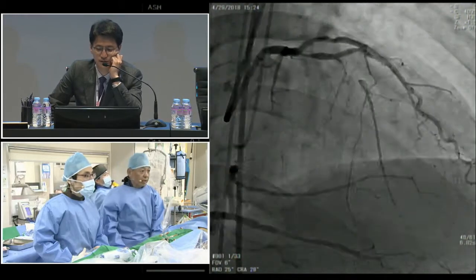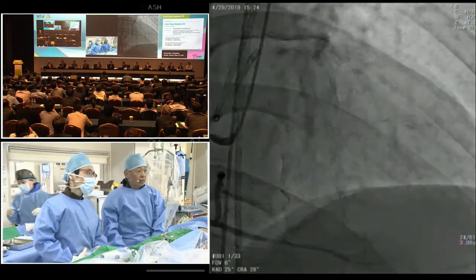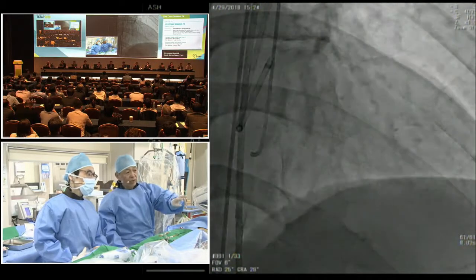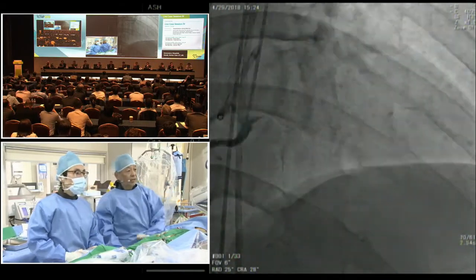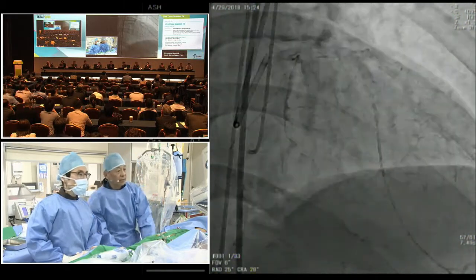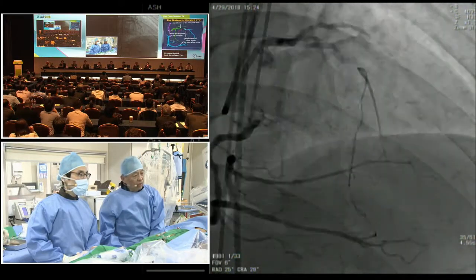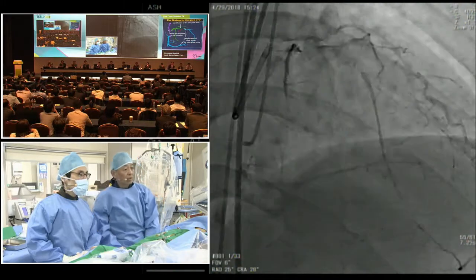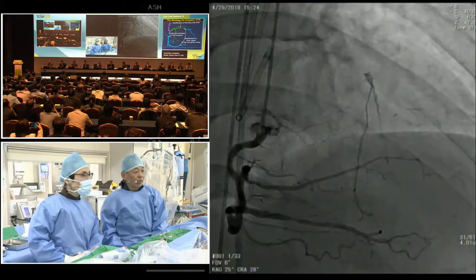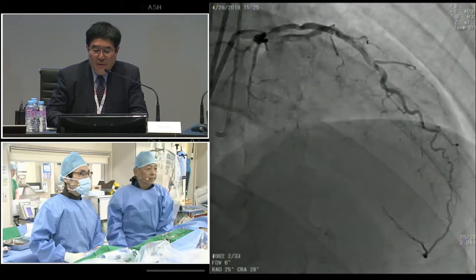Okay, I totally agree. This case is a reattempt, and the first attempt damage is so big. The current situation is a short length CTO, however a reattempt on a blunt type CTO case. So I agree to start with retrograde first in this case. And this septal route is not so suitable for a retrograde route. So I started with the apical route first. Caudal and spider view.